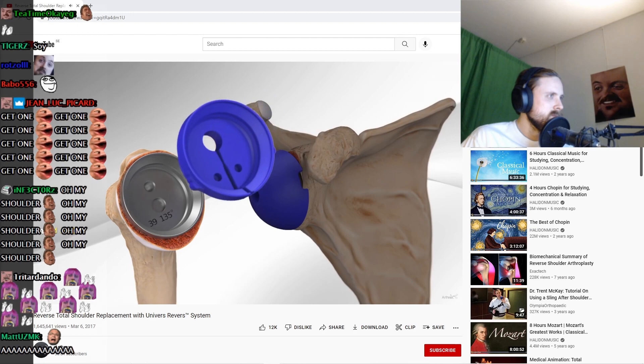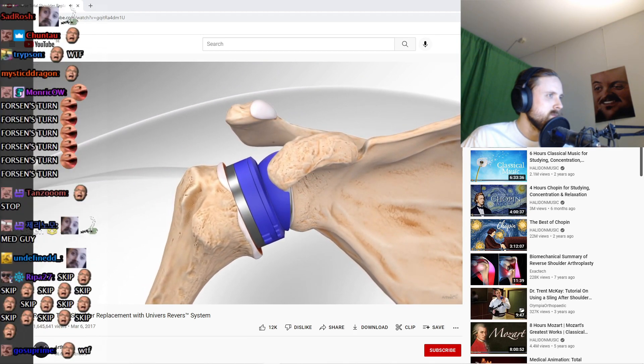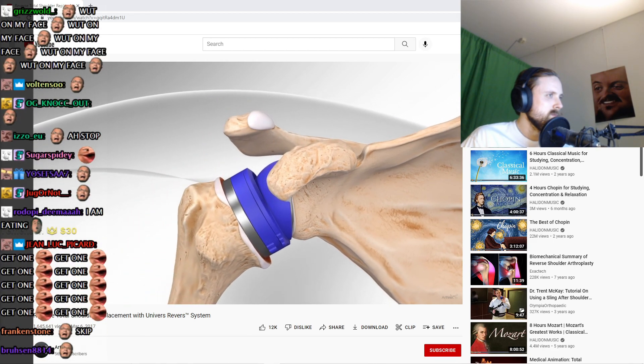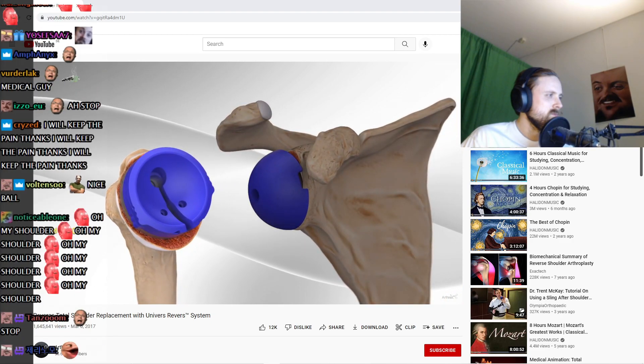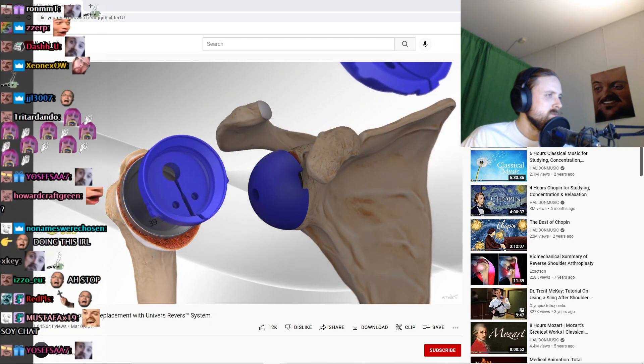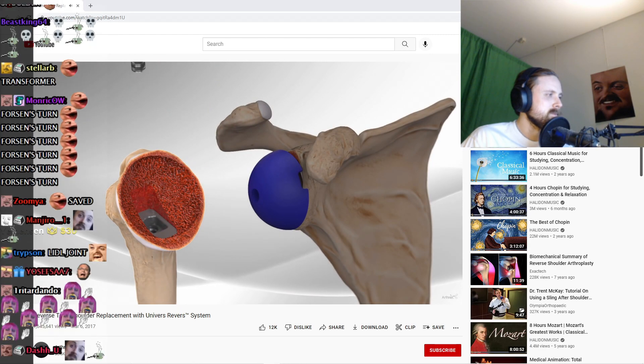After the trial implant is in place, the surgeon places the socket onto the ball and assesses the stability of the joint with the implants chosen. After appropriate sizing, tension, and stability are determined, the surgeon will then remove the trial implants on both sides of the joint.